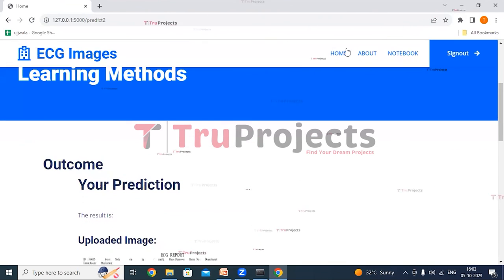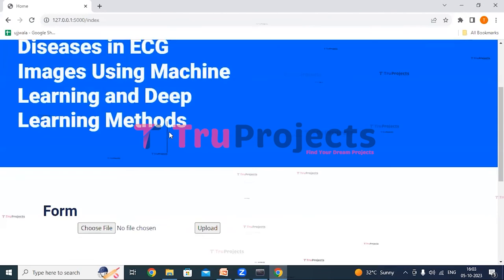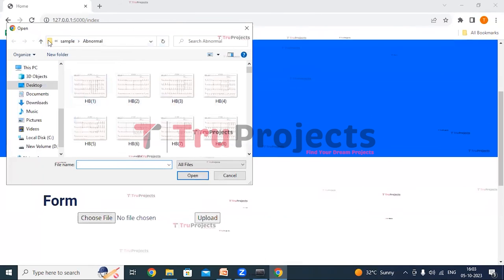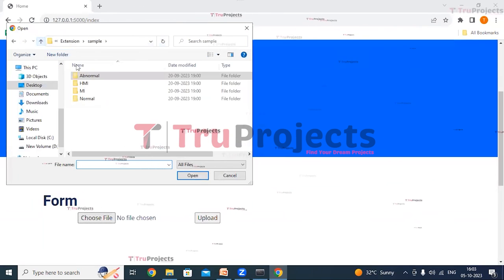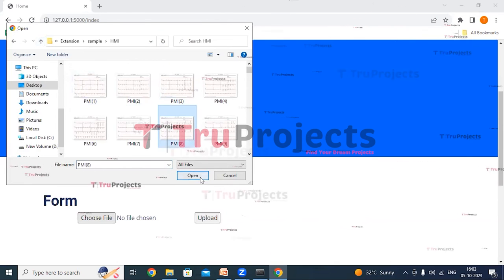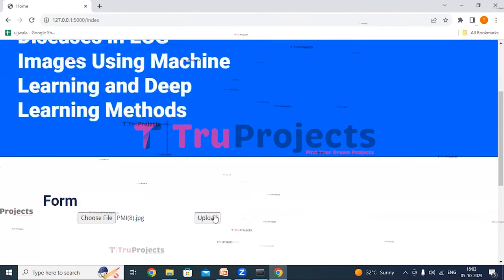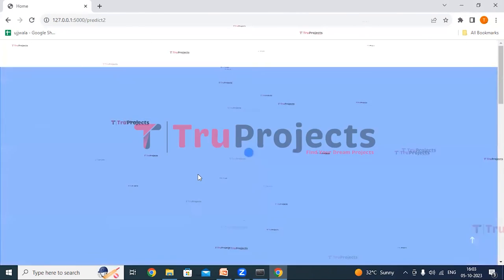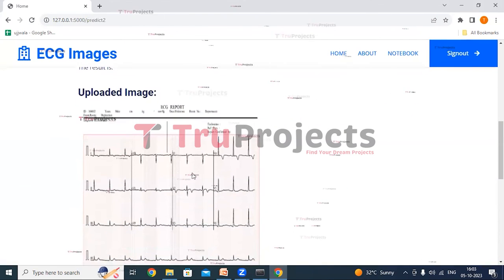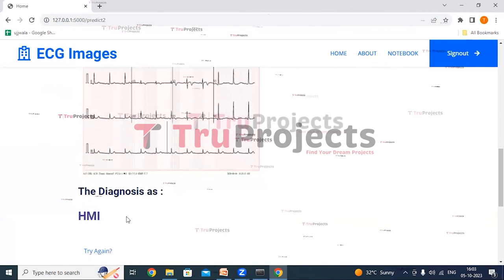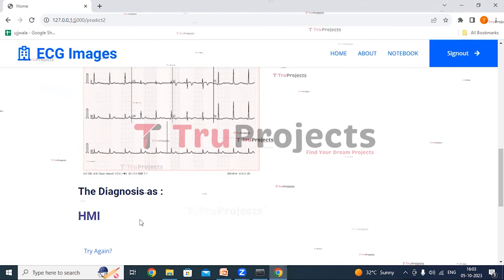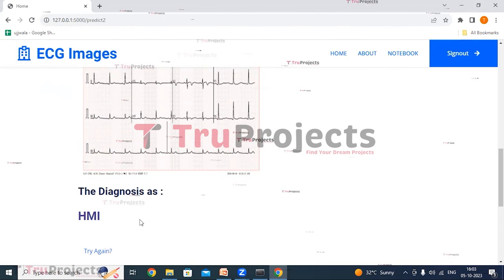Now clicking on home. Clicking on choose file button — we'll try with an HMI image now. Giving the eighth image and clicking open, then clicking the upload button. This is the uploaded image, and here we can see the diagnosis as HMI. It has correctly classified the condition as HMI.